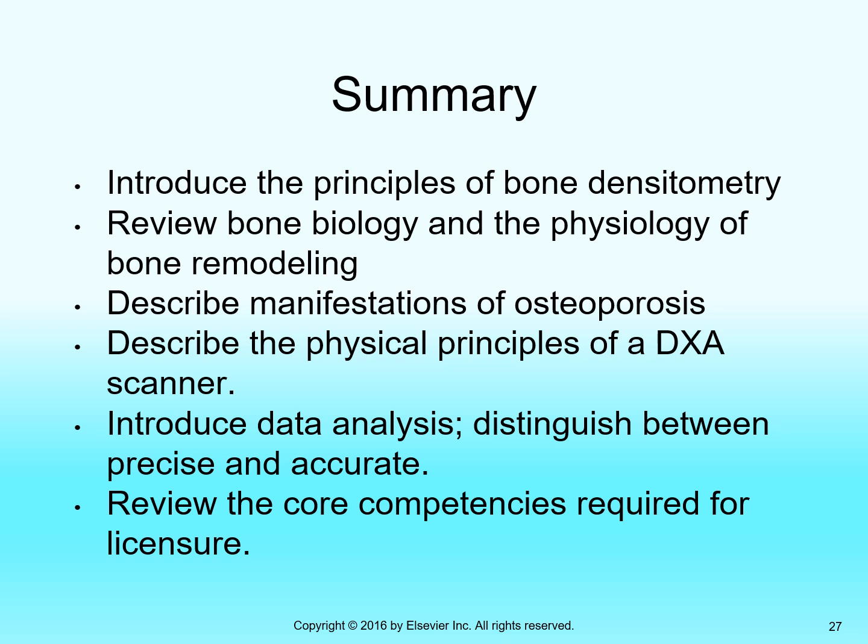So, physical principles of a DEXA scanner: it's going to be an X-ray tube, usually set up like a fluoroscope. So the X-ray tube source is in the table. The beam projects upwards toward the ceiling, and a detector or multiple detectors are fashioned above the patient. There's a targeting laser above the patient with the detectors, such that you can center accurately according to positioning landmarks.